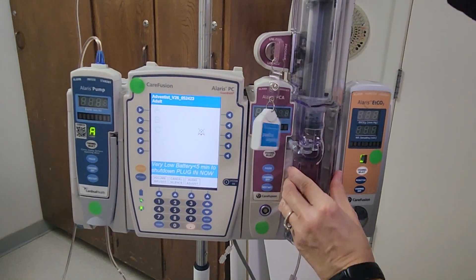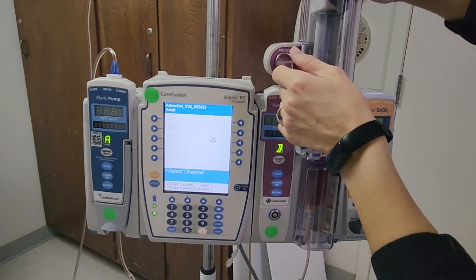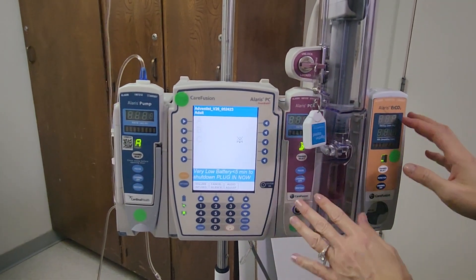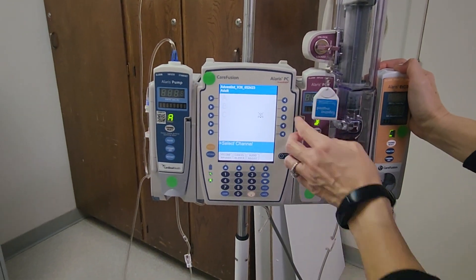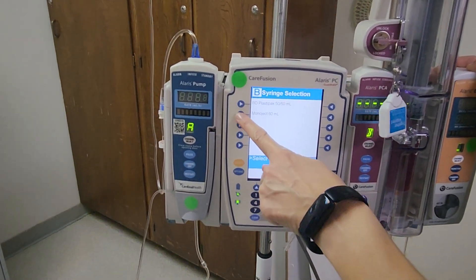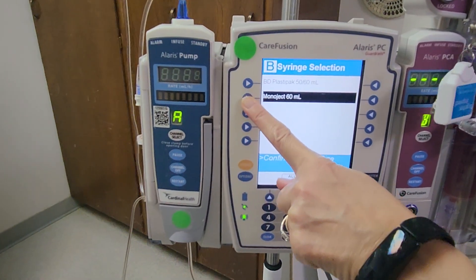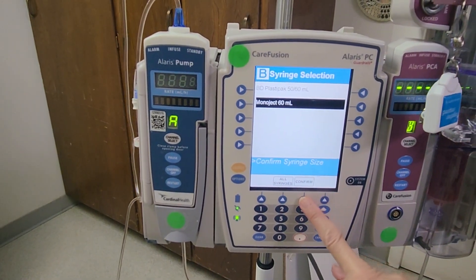Go ahead and close the door and then turn the key to the program position. Next, we need to go ahead and channel select, then select Monoject 60. It's asking us to confirm the syringe size, so confirm.